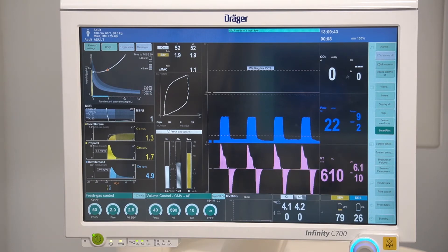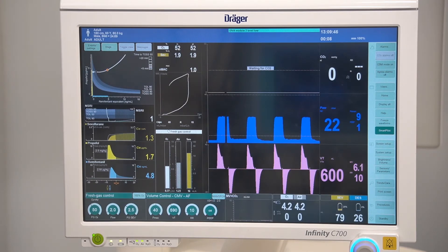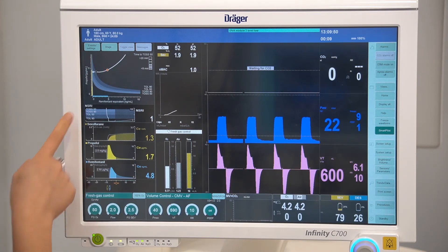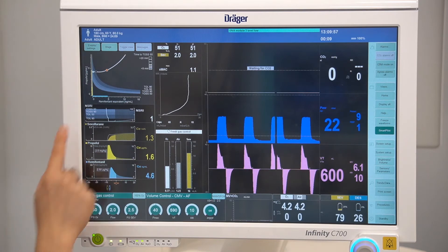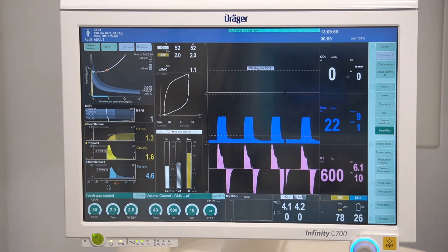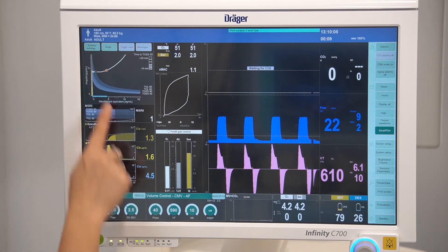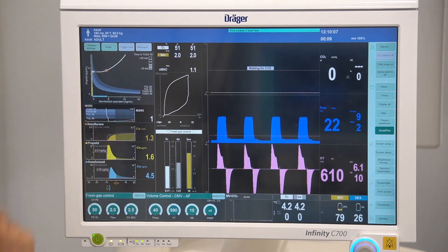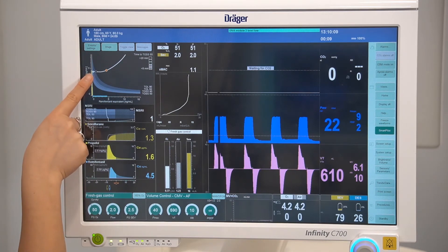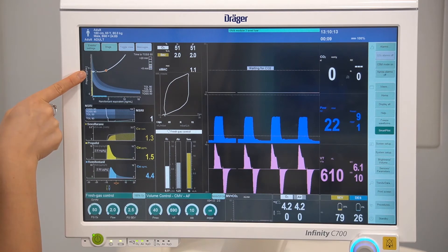Based on the effect site concentrations of all hypnotics and analgesics given to the patient, a combined effect is calculated and presented here, in which the x-axis is the analgesic effect and the y-axis is the hypnotic effect. The orange dot represents now, the black dot represents a 10-minute prediction, and the arrow represents a 20-minute prediction.